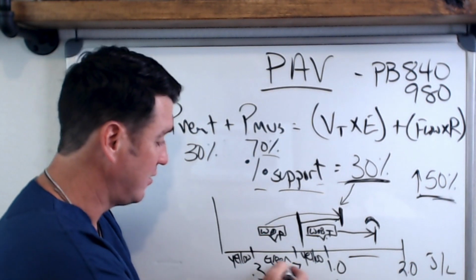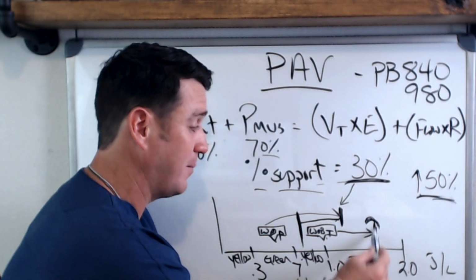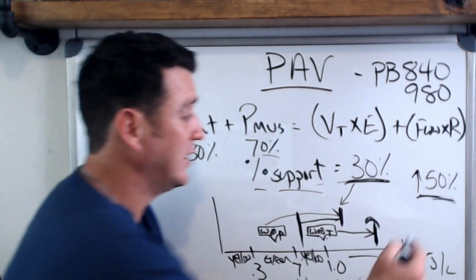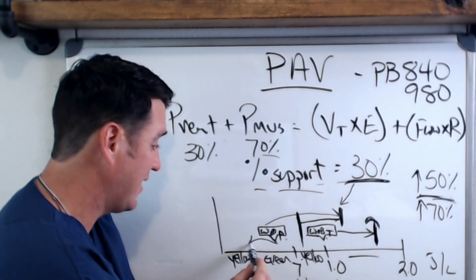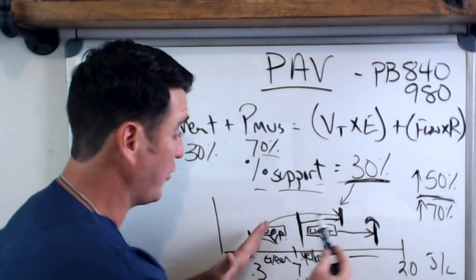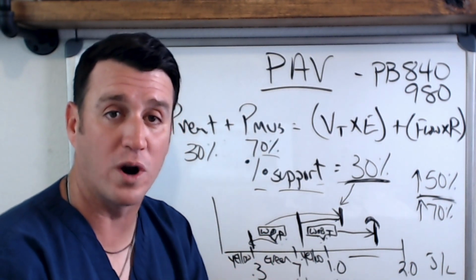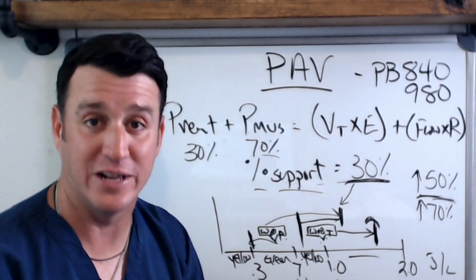The patient is in the green zone, or maybe the yellow, but your total work of breathing is way over here close to 2. It tells you, okay, well, this isn't okay. We don't want to extubate from this, right? If you increase it to 70%, you can get the patient's work of breathing way back here to where they're having to do very little work. But the further apart these two tabs are, patient work of breathing versus total work of breathing, is an indication for you on how much work of breathing is being compensated or made up for by the mechanical ventilator.